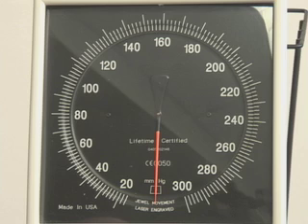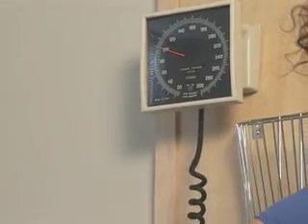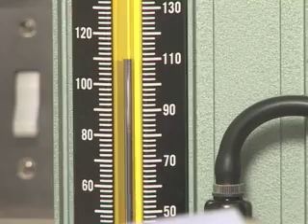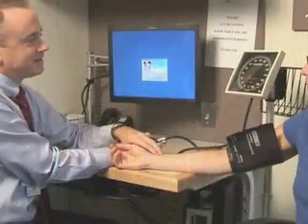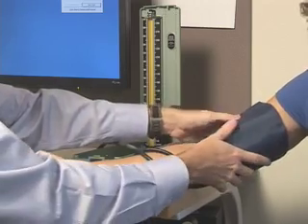The needle on an aneroid manometer should rest at zero before and after measuring blood pressure. Aneroid manometers should have scheduled recalibration at least every six months. Concerns over the toxicity and environmental impact of mercury have led many institutions to use aneroid manometers exclusively. The steps required for accurate indirect measurement of blood pressure are identical whether using an aneroid or mercury manometer.